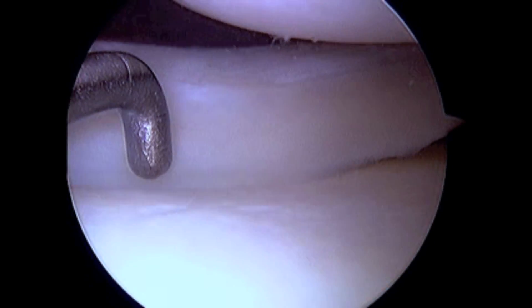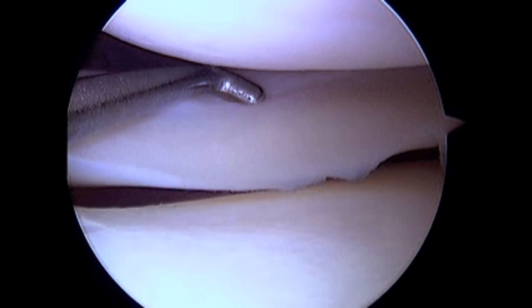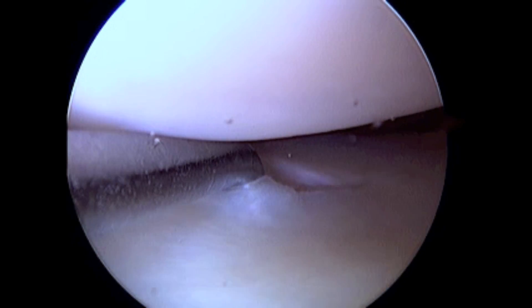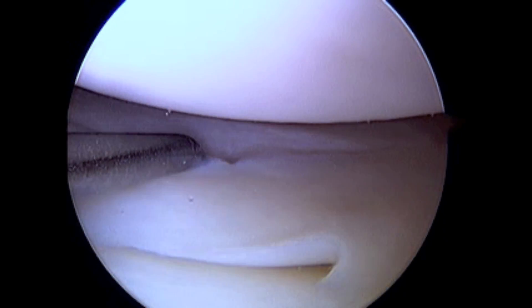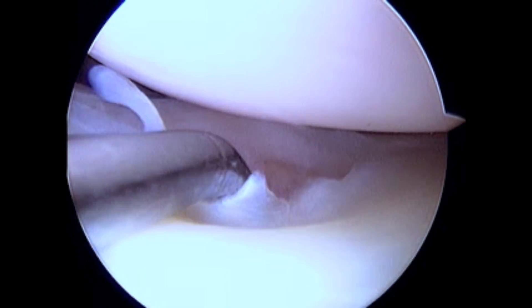The tear demonstrated is in a highly competitive 24-year-old male athlete. This is an acute complete longitudinal tear at the outer periphery of the posterior horn of the lateral meniscus. The tear is three centimeters long and within three millimeters of the meniscal capsular junction. As you can see, this is an unstable tear pattern with an easily displaceable inner meniscal fragment.